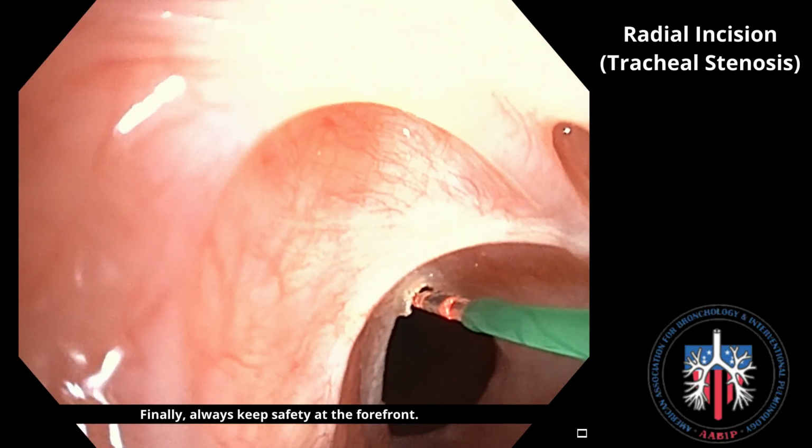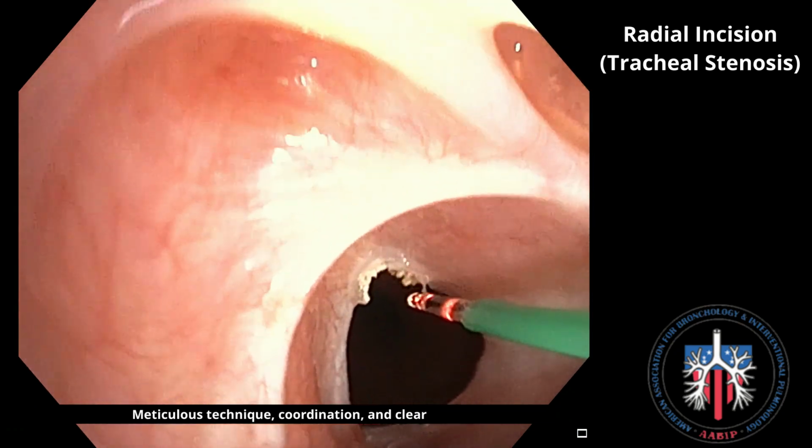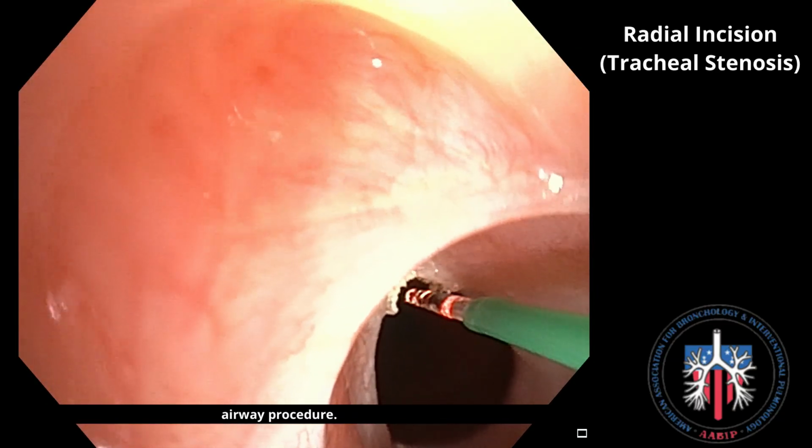Finally, always keep safety at the forefront. Meticulous technique, coordination, and clear communication are key to a successful and safe laser airway procedure.